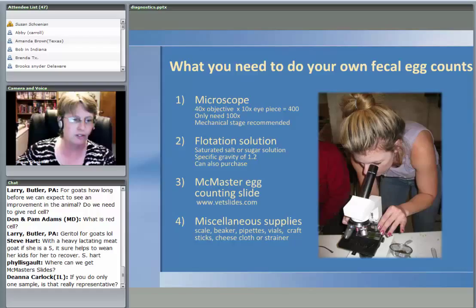Somebody had asked a question about where you get the McMaster egg counting slide. It's a Chalex Corporation, which specializes in parasitology on equine. They're one of actually two sources. I believe there's a second source of those slides now. But if you just type in vetslides.com, you will go to that website. They actually sell a kit with a couple of slides, and they recommend a technique where you don't actually weigh the feces, but you determine the weight by volume displacement.